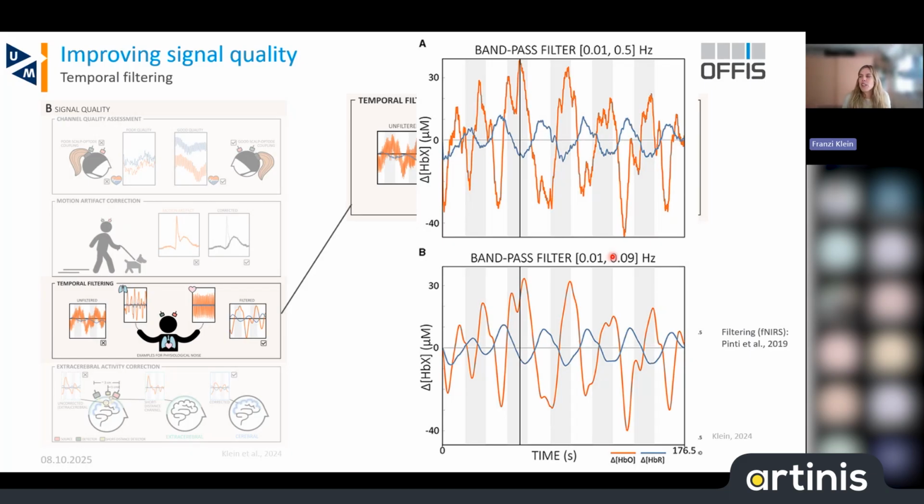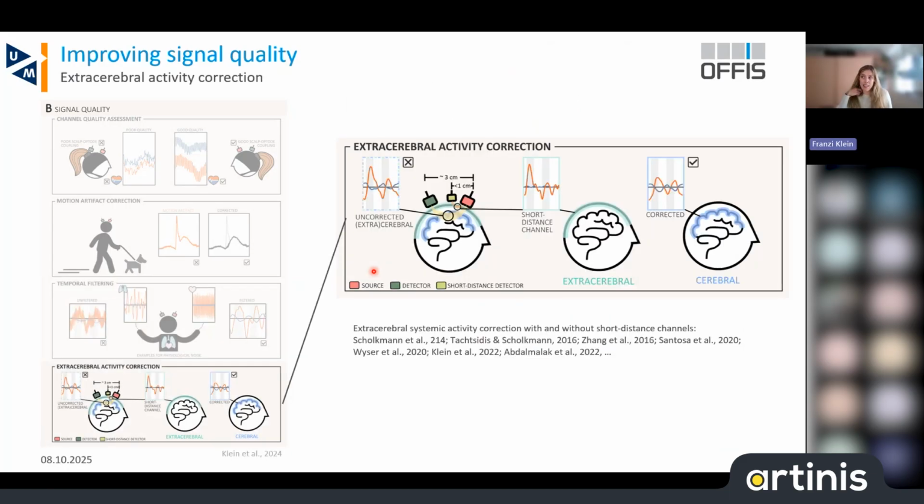And there are, of course, some more things you have to take into account when designing your real-time application, and also think about filtering. And then another topic which is quite important, I would say, is the correction of extracerebral systemic activity.